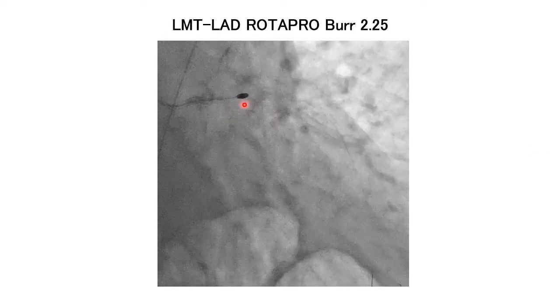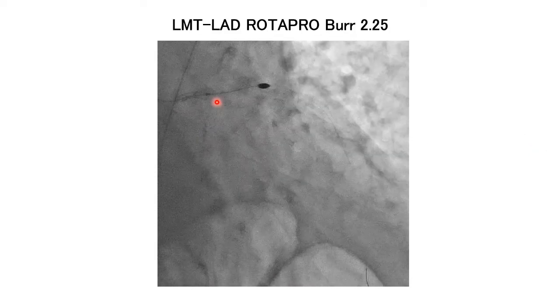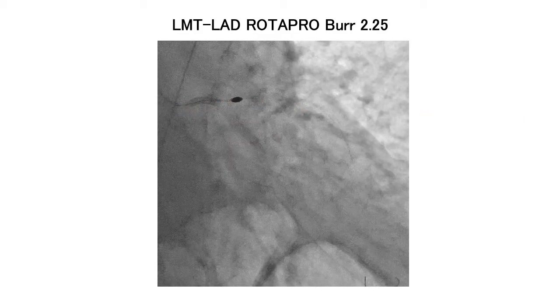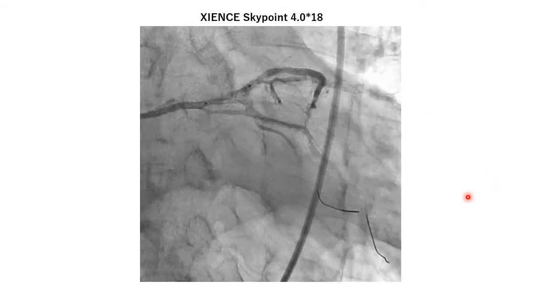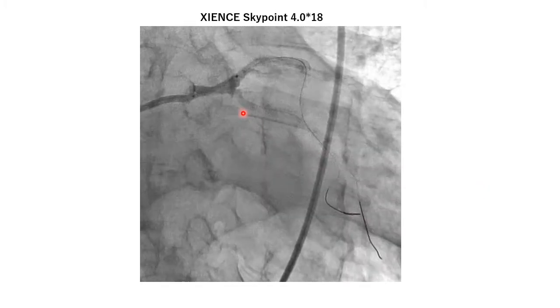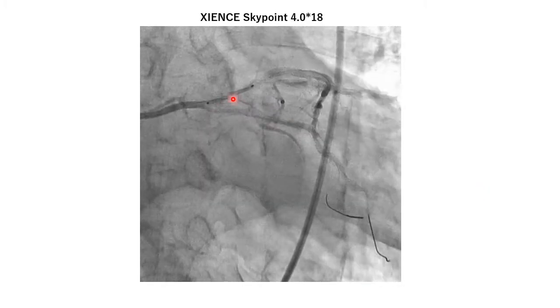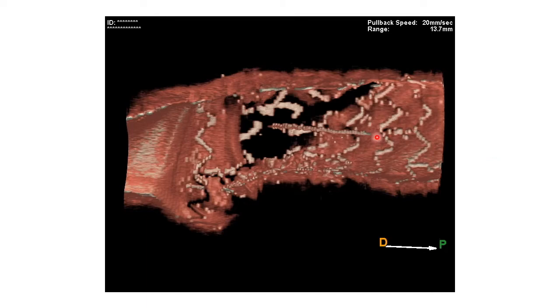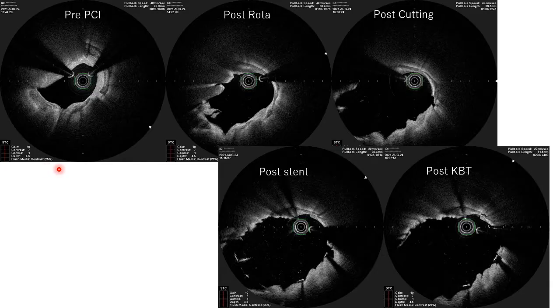For the left main trunk to LAD, the vessel is in a straight form, so rotablation was performed from LMT to LAD. A Xience Sky Point 4.0x18 stent was implanted from LMT to the LAD. The guidewire was crossed to the circumflex, and the crossing point looks okay. The stent link and LMT distal stenosis lesion are identified here.